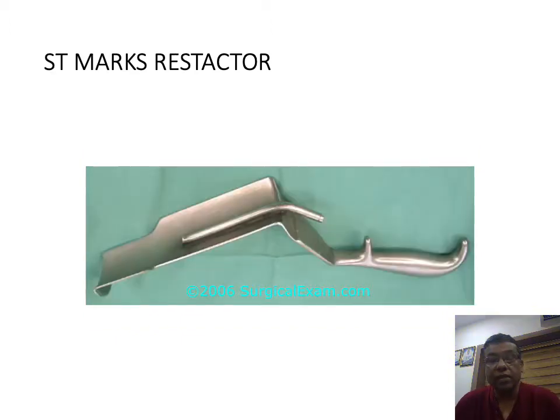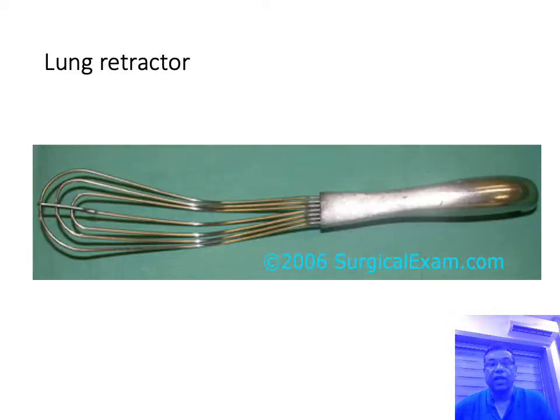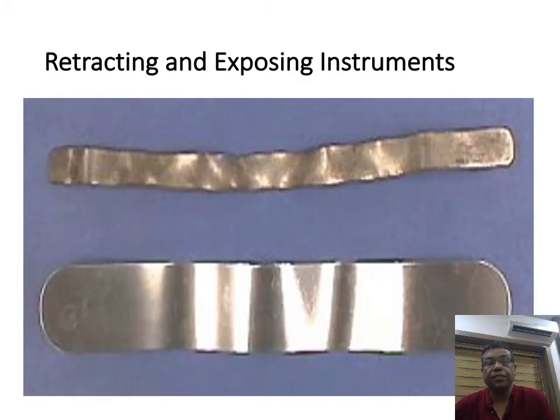This is a St Mark's retractor, ideally used for deeper surgeries to visualize deeper structures. There is also a provision to attach lights, and it is used for pancreatic surgeries. This is a lung retractor — you can see its typical appearance — used for retracting the lung when doing esophagectomies and thoracic surgeries.